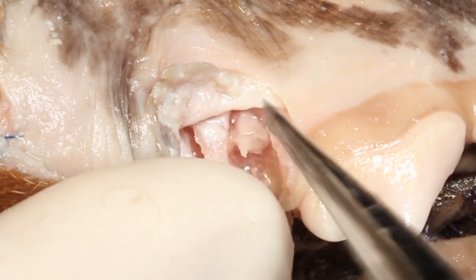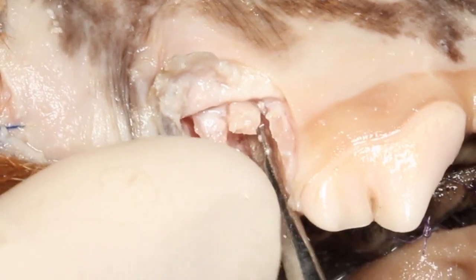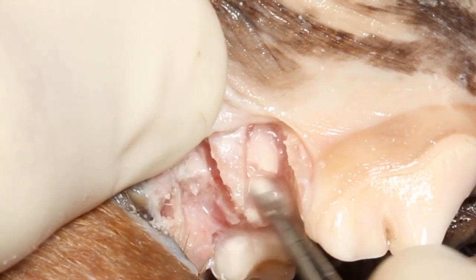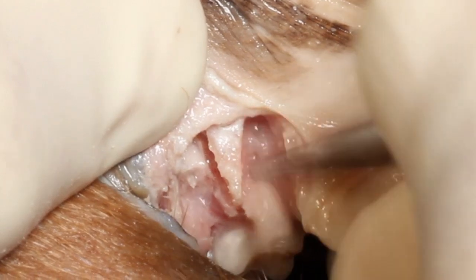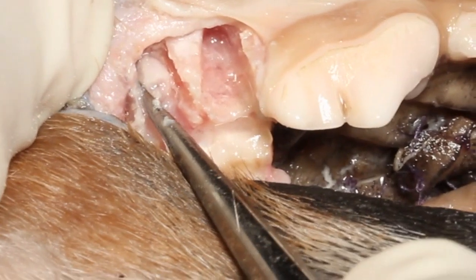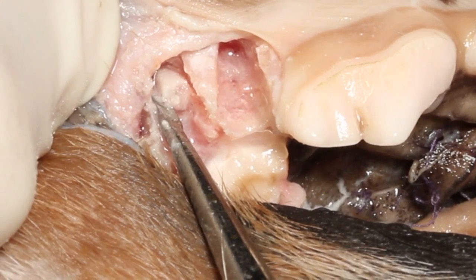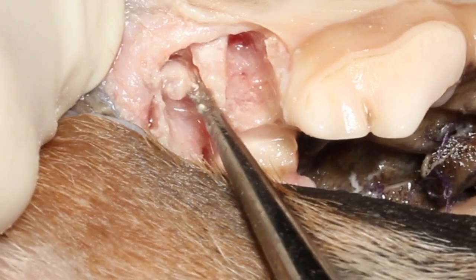Even with considerable time during elevation, we're still having a difficult time getting mobility with that tooth root, and that is pretty typical of that particular tooth — the roots are fairly long and often curved. To properly extract these roots, we have to take a lot of time with our luxation and remove vestibular bone for good access to avoid fracturing them in the first place. With good access you can expose the root tips, remove bone on the vestibular, mesial, distal, and palatal sides, then extract the tips with your luxator or elevator.